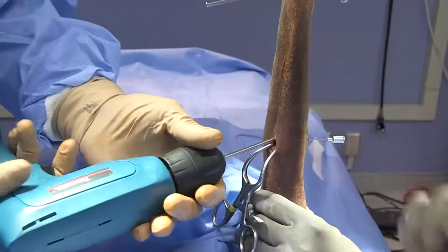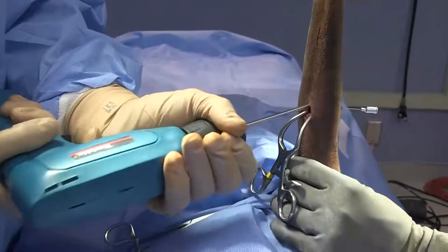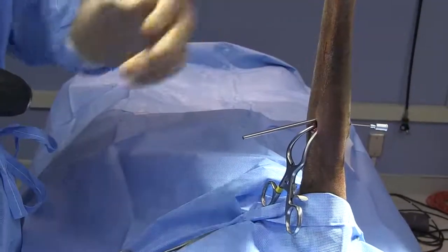I can feel that pin on the opposite side coming right out of the opposite cortex. We don't want to go any further than necessary to have that pin engaged in both cortices. We'll go ahead and take our drill off — we've now got our most proximal and most distal pin sites placed.